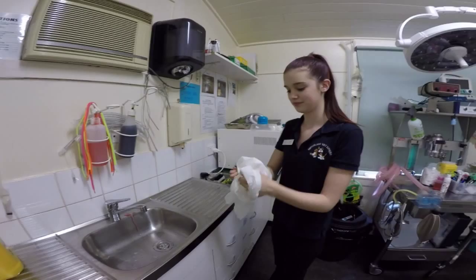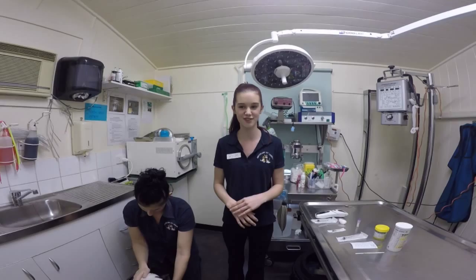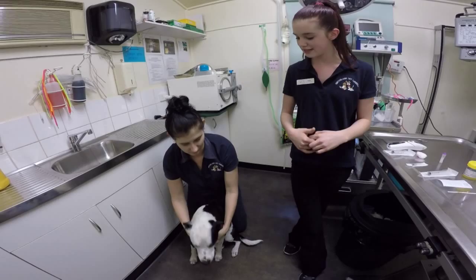My practice manager Nicole will restrain Ruby while I take her blood. As she is a much larger dog it will be much easier to take her blood on the floor rather than the examination table. Nicole will restrain Ruby by having her sit first, bringing herself behind her, holding her chest with her right arm and her head up high with her left arm. Nicole will be relaxed but firm in case she jumps.